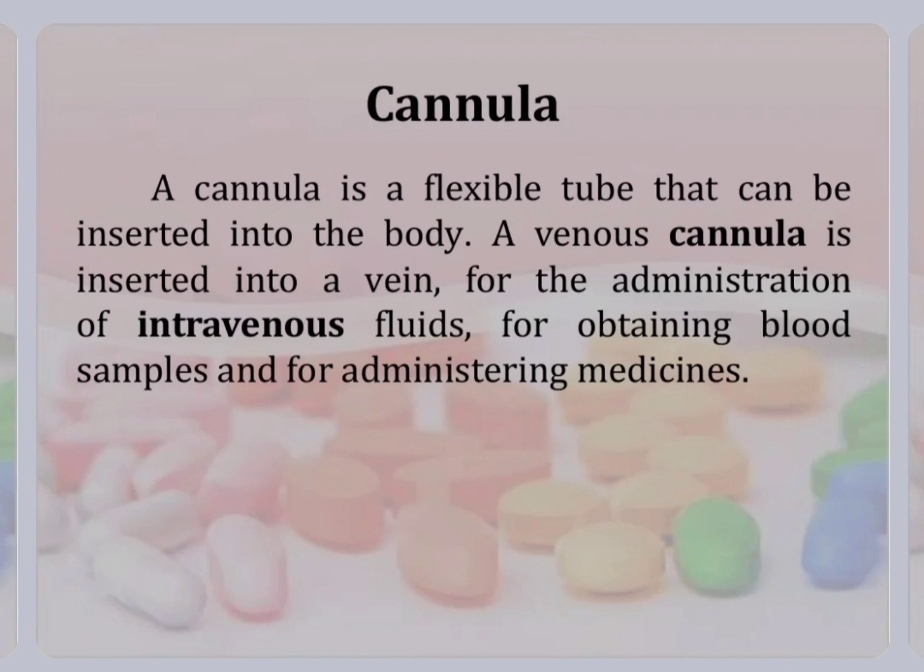Simply, a central line is an intravenous line, meaning we insert a catheter into the vein, but in a central line the IV cannula or IV catheter goes deeper into the deep veins of our body, and mostly it goes into the veins near the heart, or just inside the heart, compared to a peripheral venous line. Peripheral venous lines are in the periphery of our body, that means superficial in our body. And the peripheral venous line or IV cannulation, you can say, we call by different names.